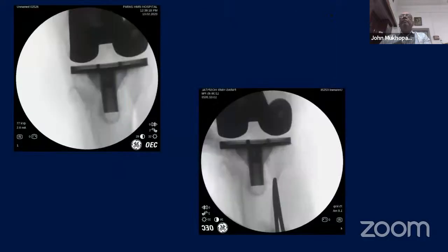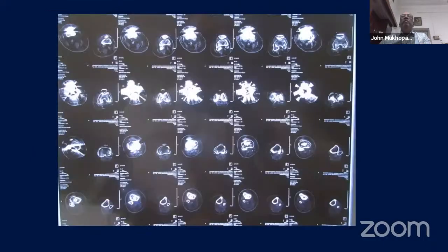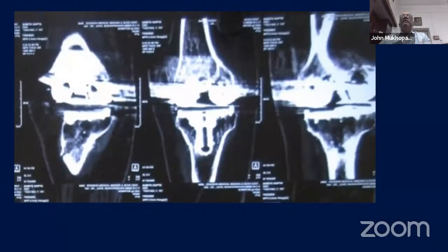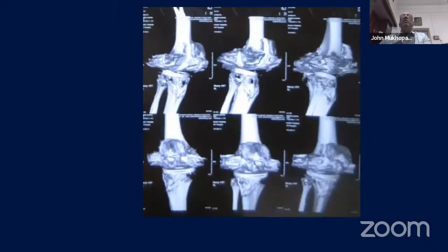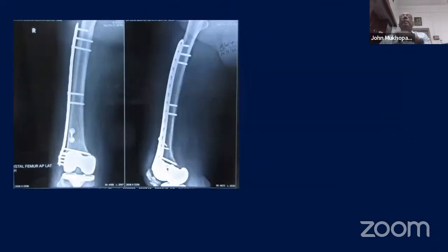And we ended up having to put a buttress plate on the medial side. Again, it would be useful to have polyaxial screws to avoid the peg where you can, and this buttress plate then went on to heal well. So the CT scan just showing you the fracture because you could hardly see it without the implant. And there's another, and this is post fixation.